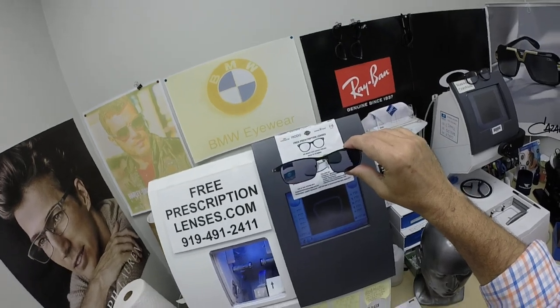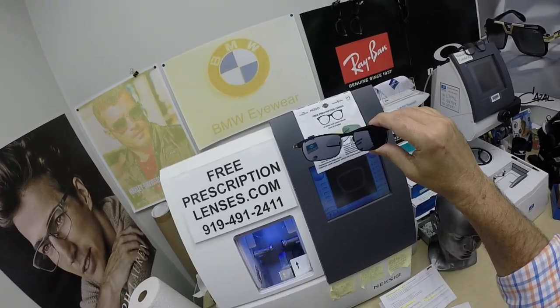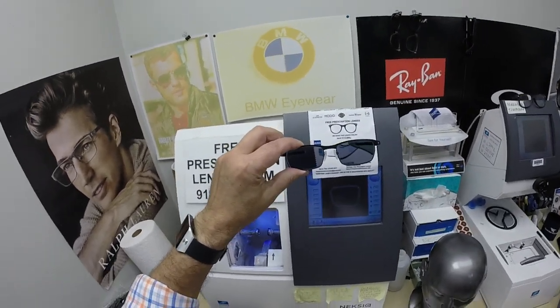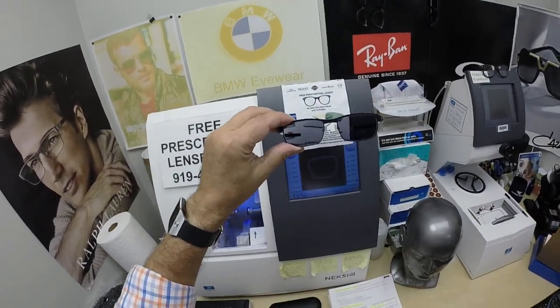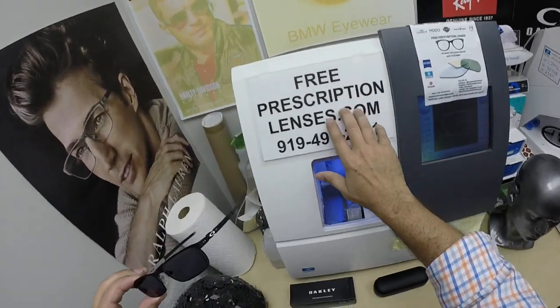They will actually block 98% of harmful blue light — forget what I said in my earlier videos, they block 98%. While clear, it's about 50 to 70%, and then 98% once the lenses have been activated, meaning once they're dark. So that's it!